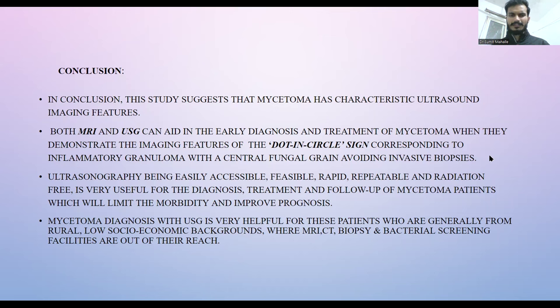Ultrasonography being easily accessible, feasible, rapid, repeatable, and radiation-free is very useful for diagnosis, treatment, and follow-up of mycetoma patients, which will limit the morbidity and improve the prognosis. Diagnosis of mycetoma with USG is very helpful for these patients who are generally from rural, low socioeconomic backgrounds, where MRI, CT, biopsy, and bacterial screening facilities are out of their reach. So, USG really plays a key role in these patients who live in rural areas and low socioeconomic backgrounds.